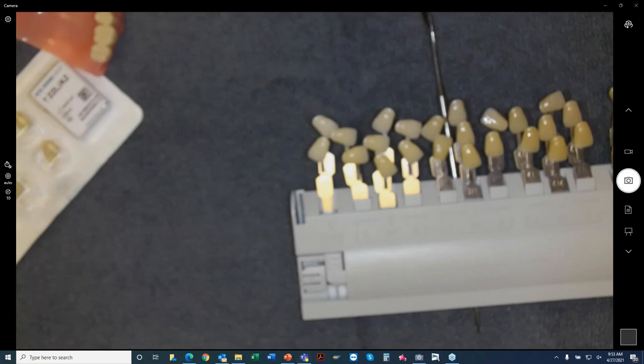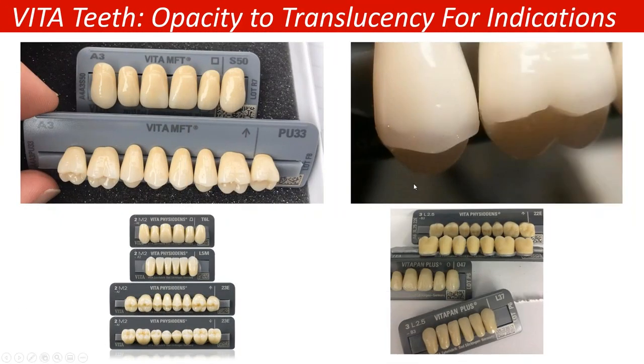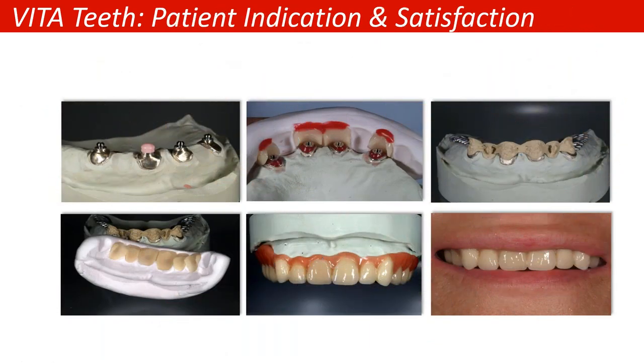So I'm going to go back to my PowerPoint here. And we will get this done. So we talked about layering. We talked about where you have different teeth that have different opacities, translucencies. You're going to use that as an advantage if you're doing fixed denture work that you need to mask something out with. You need a tooth that has a high enough opacity to mask out that metal.